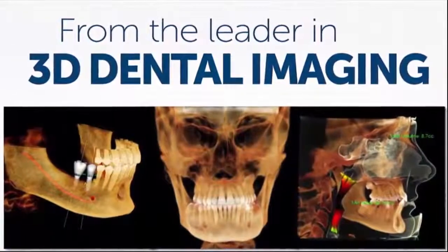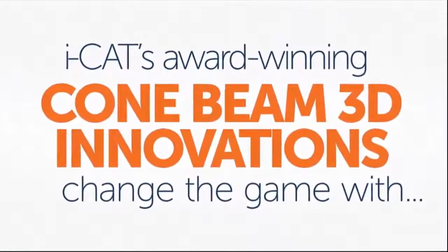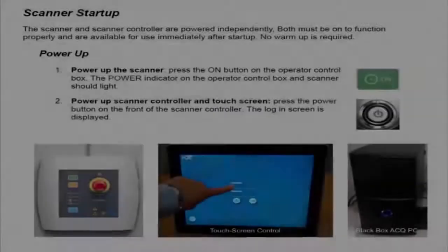I would like to welcome you to an iCAT Flex training video demonstrating the simplicity of patient scheduling and image acquisition. Using the iCAT Flex with SmartScan Studio or DEXIS Imaging Suite and TX Studio, you will quickly capture exam data and view images for treatment planning.